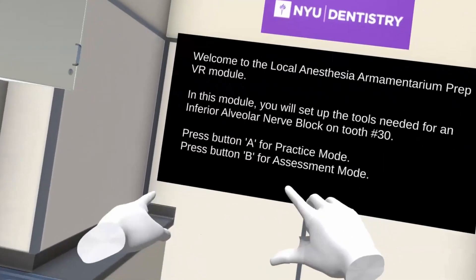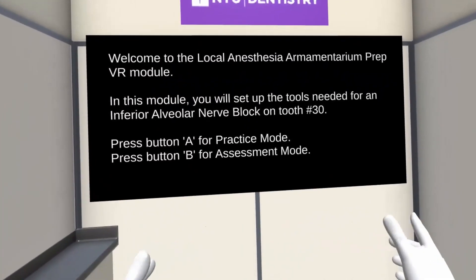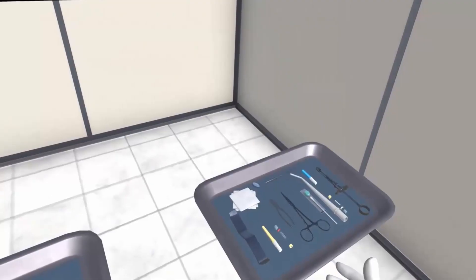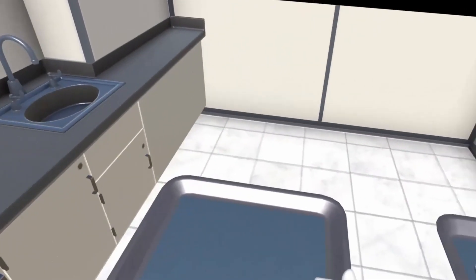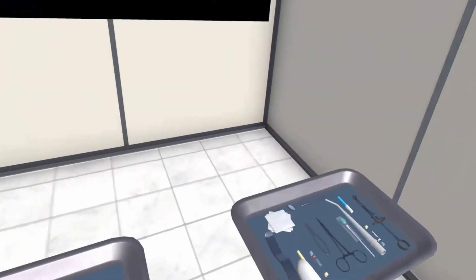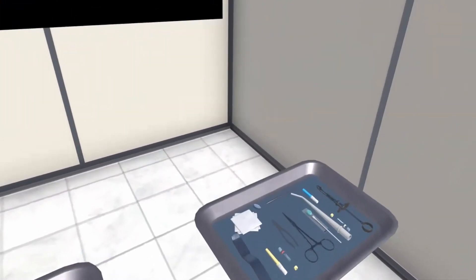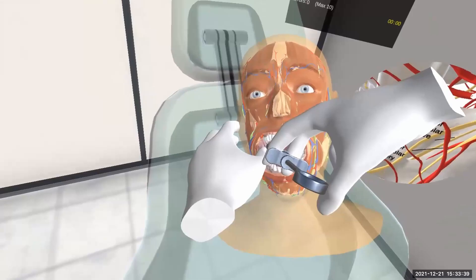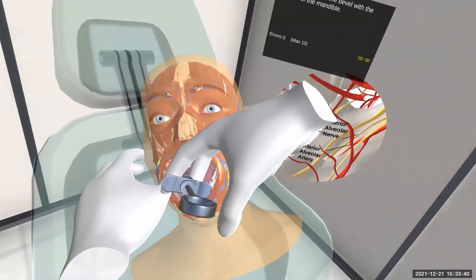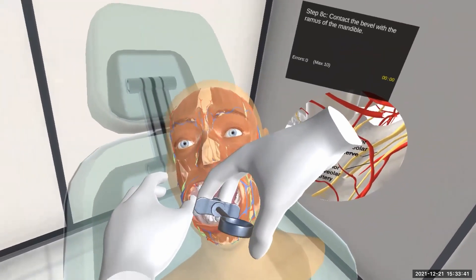This virtual simulation is divided into two parts. The first part is the setup of the armamentarium needed for applying the block, and the second part is to apply the block itself.